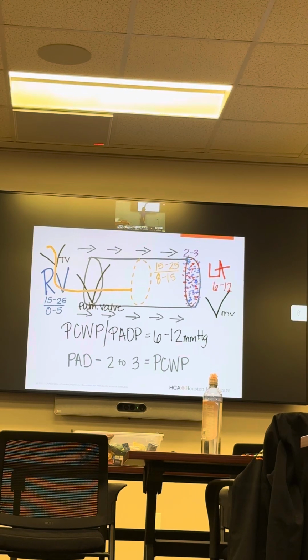And when we inflate that balloon and we occlude the flow in that tube, what it's really doing is pressurizing this pulmonary capillary bed, effectively moving the curtains so that it can see into the left atrium. So if the balloon is not inflated and the catheter is just sitting in there, then we have to take into account this pulmonary capillary bed. That balloon's real small. That's not a whole lot of pressure to have to overcome, typically.